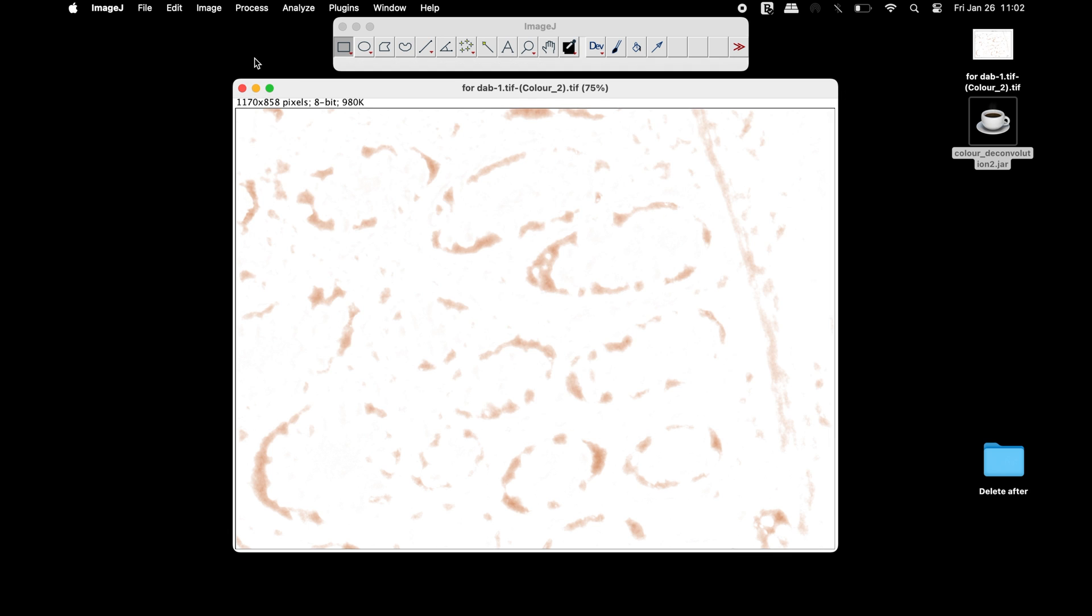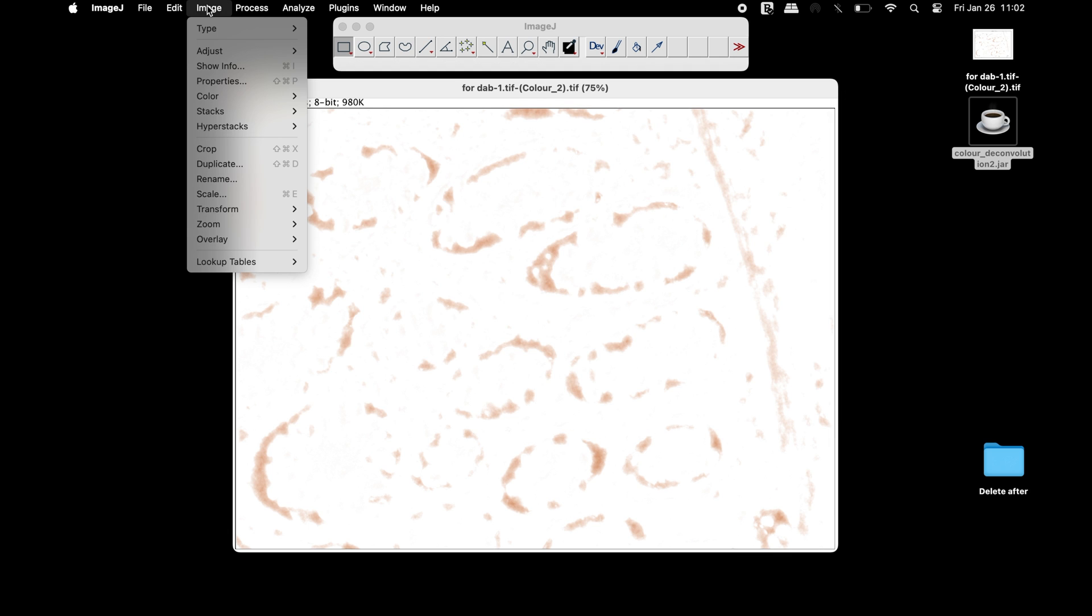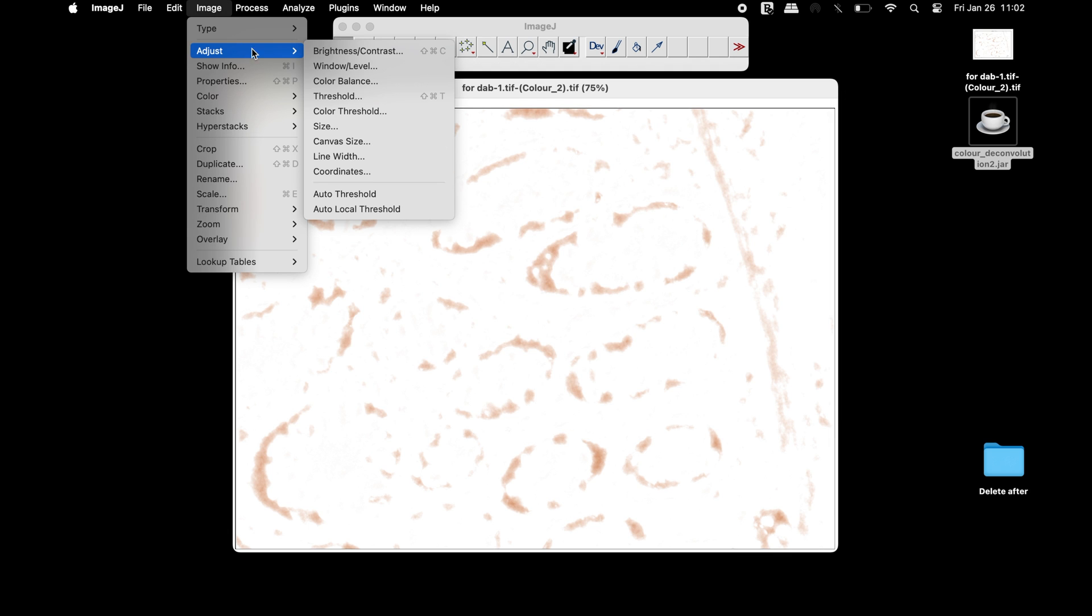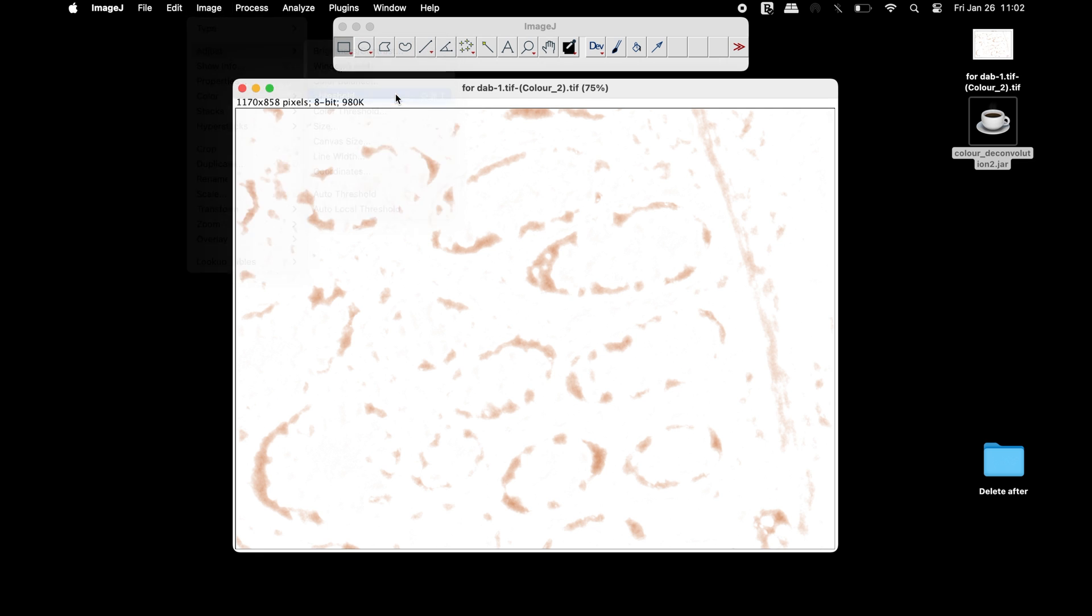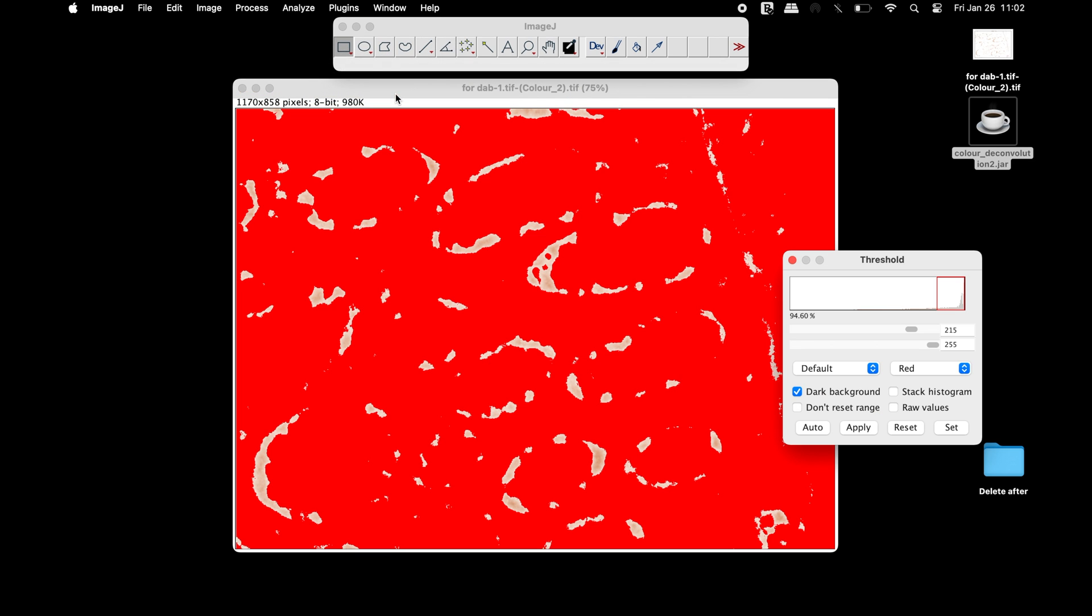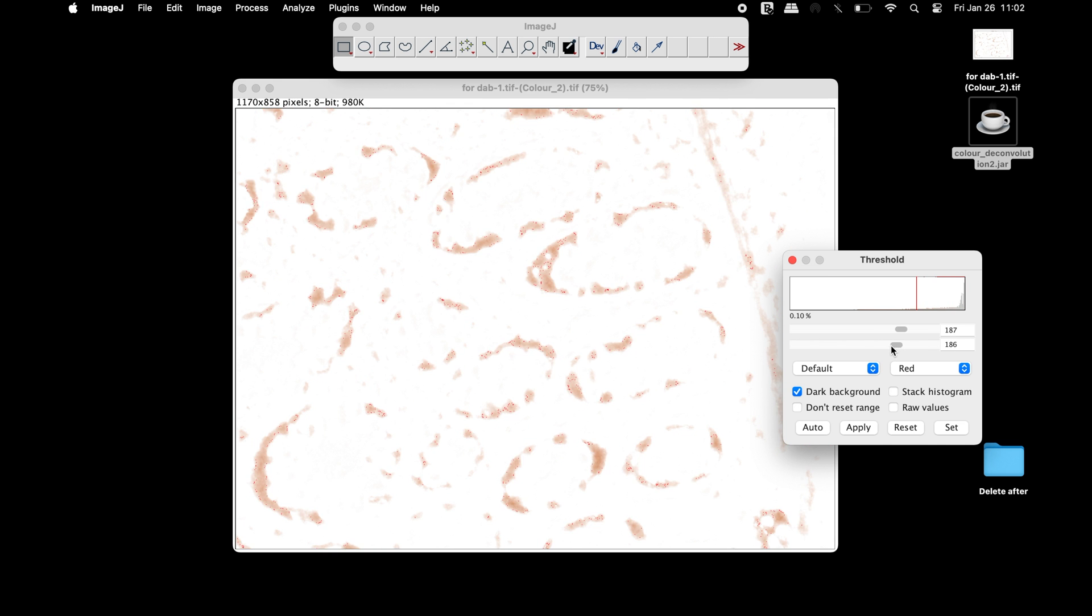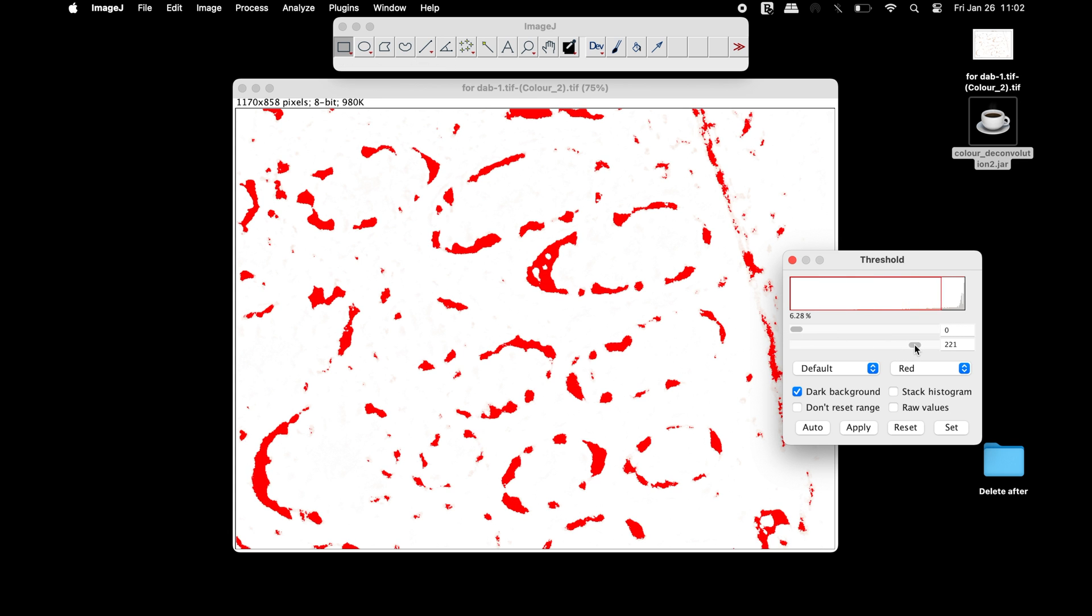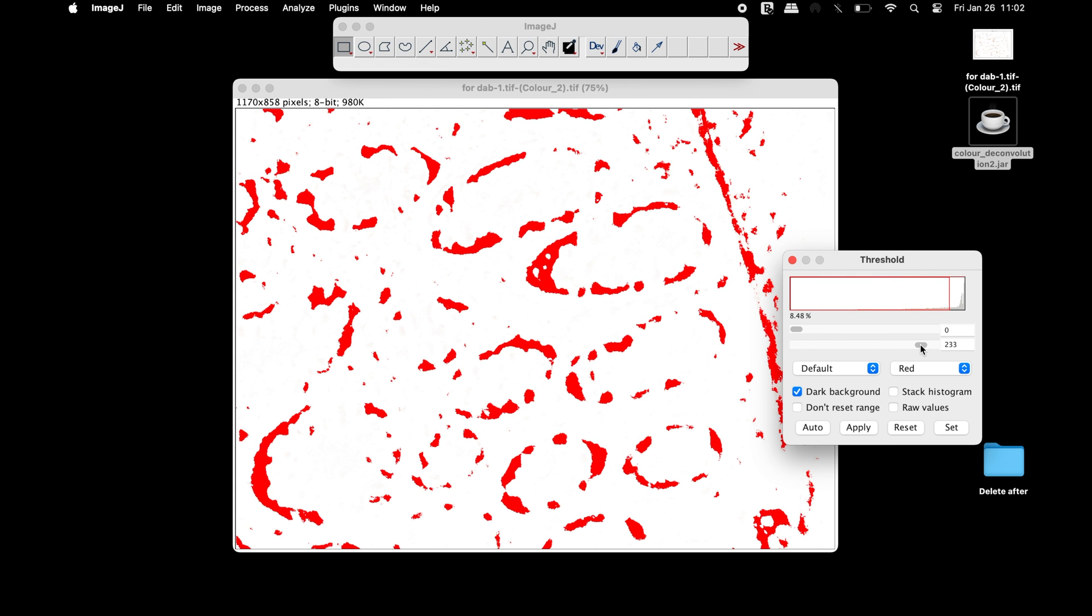Now, let us quantify the DAB staining. The first step is to threshold the DAB staining. Adjust the threshold such that the DAB staining or the foreground is red in color with a white background.